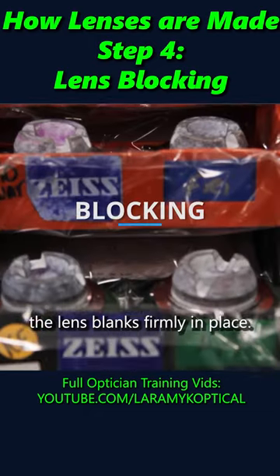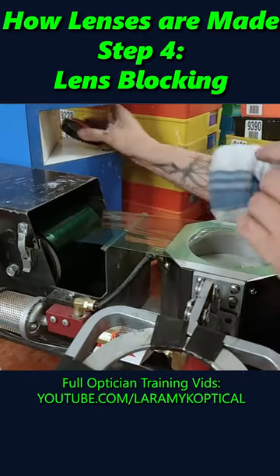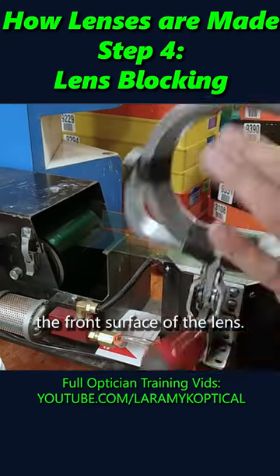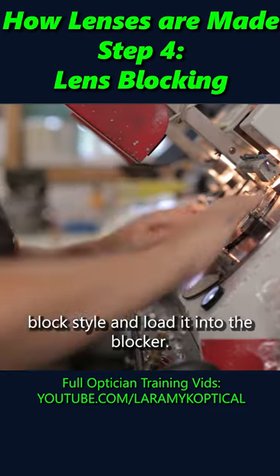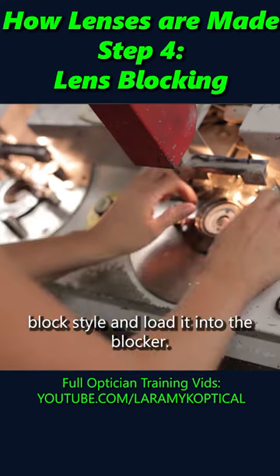Blocks are what hold the lens blanks firmly in place. The first step is to protect the front surface of the lens. The operator will now choose the appropriate block style and load it into the blocker.